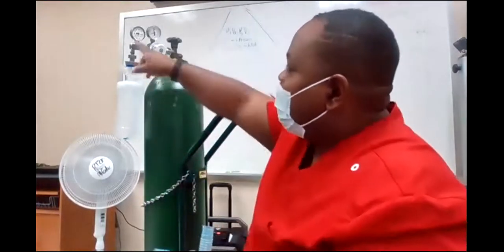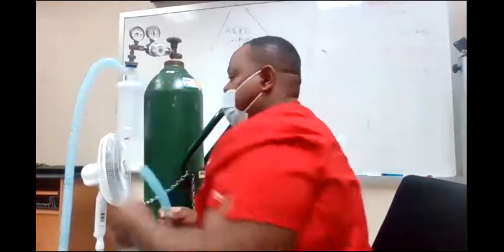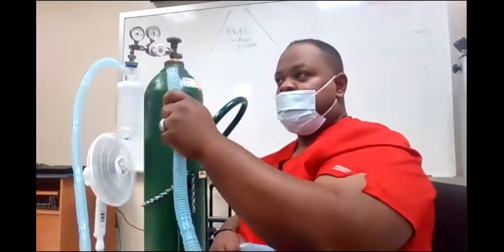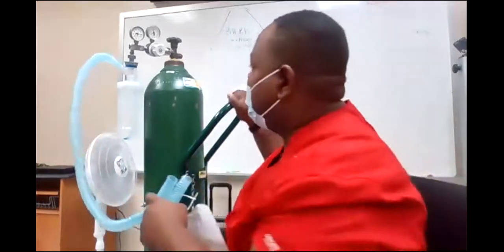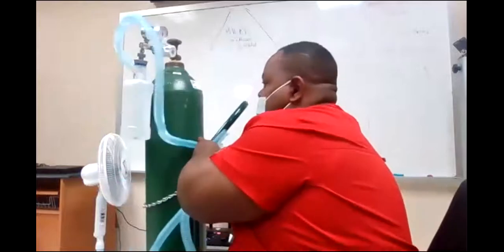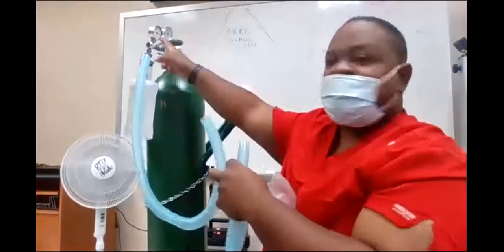And so that is my system. I have them on a aerosol face mask. Okay, so that's going to be coming eventually through here. It's hard to see. See that? See that on at home now behind this green cylinder right here? Let me see. You see it on the camera? Okay. You can see it faintly. Okay, good. So this is an aerosol coming out of here, okay? And that's 40%. Well, let me see what I got it on. Yeah, 40% at 15 liters per minute.